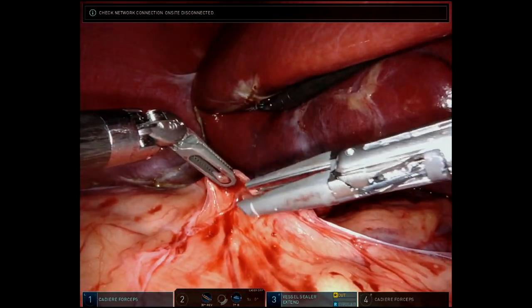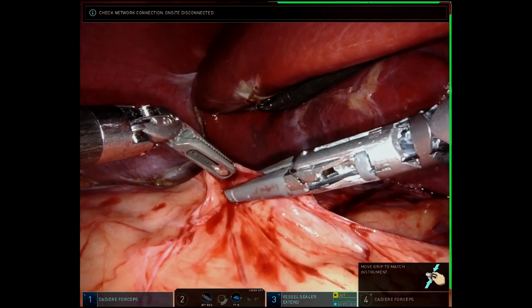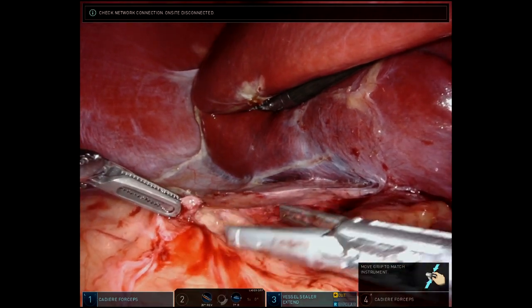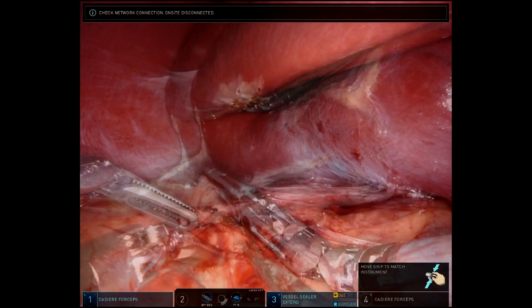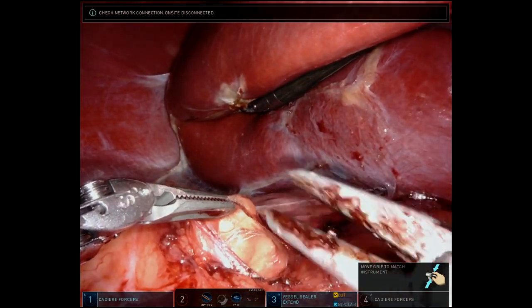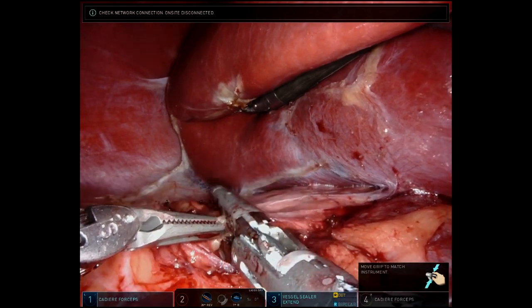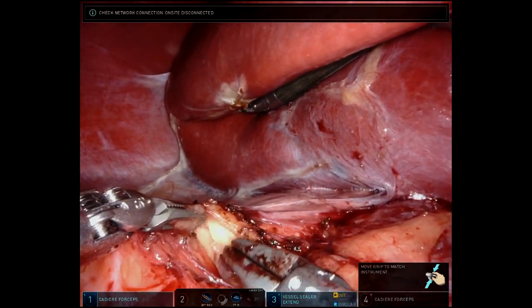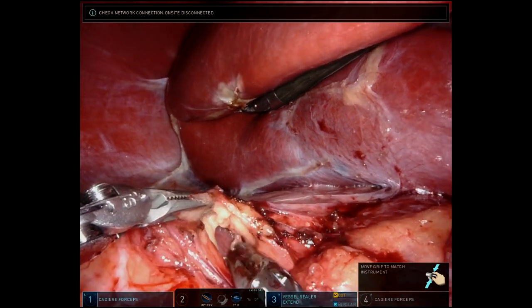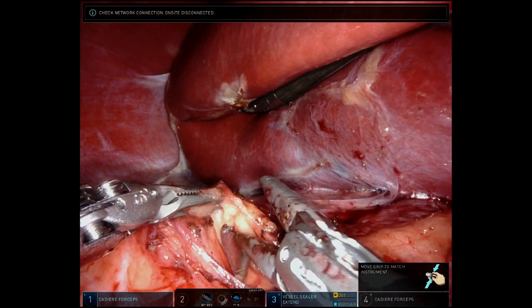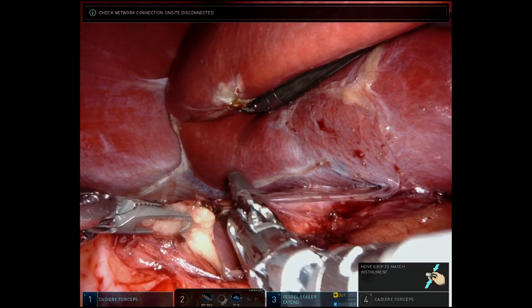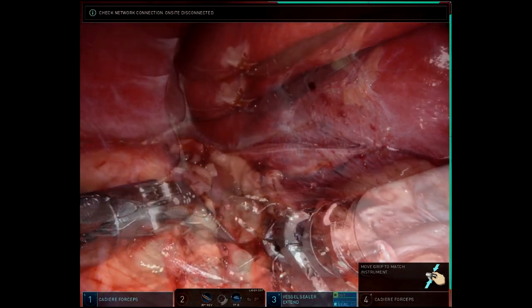Dissection of the adrenal gland is begun by opening Gerota's fascia at the superior medial aspect of the kidney. Dissection is continued laterally, clearing all retroperitoneal fat from the superior aspect of the kidney. During this dissection, four cc's of indocyanine green solution is injected intravenously. This will be taken up by the adrenal gland within minutes.